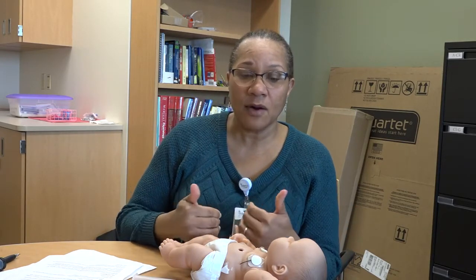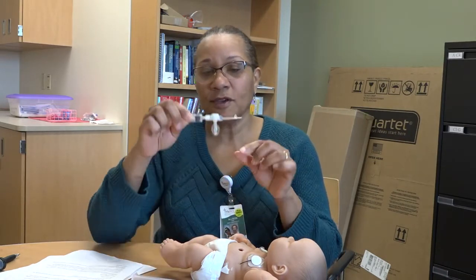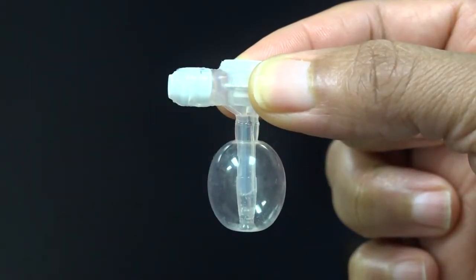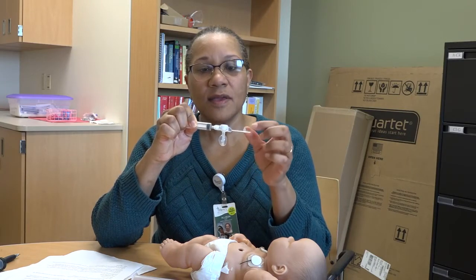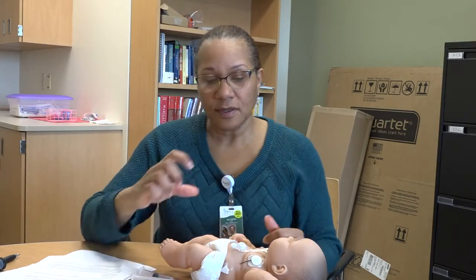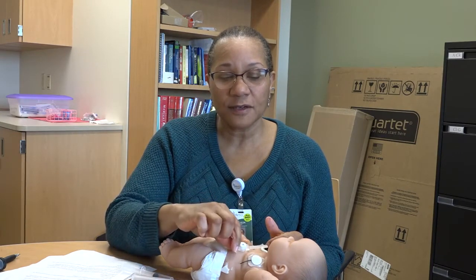Okay. One of the things that parents get really excited about, and for good cause, is if the G-tube were to come out, okay? And so, as I shared with you before, the only thing that's keeping this G-tube in place is the water that's in the retention balloon, okay? So if there is a problem with the retention balloon, such as a slow leak or water has evaporated from it, and we don't have the balloon holding it in place, then of course it can come out. So if this were to come out, tube dislodgement is what we call it.